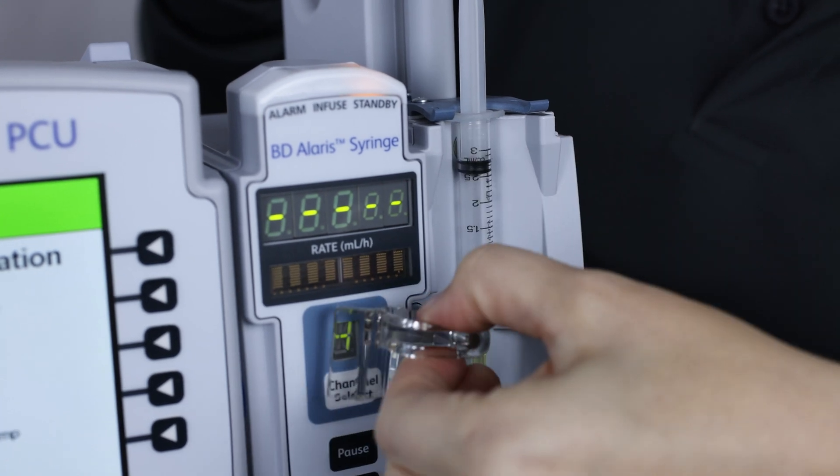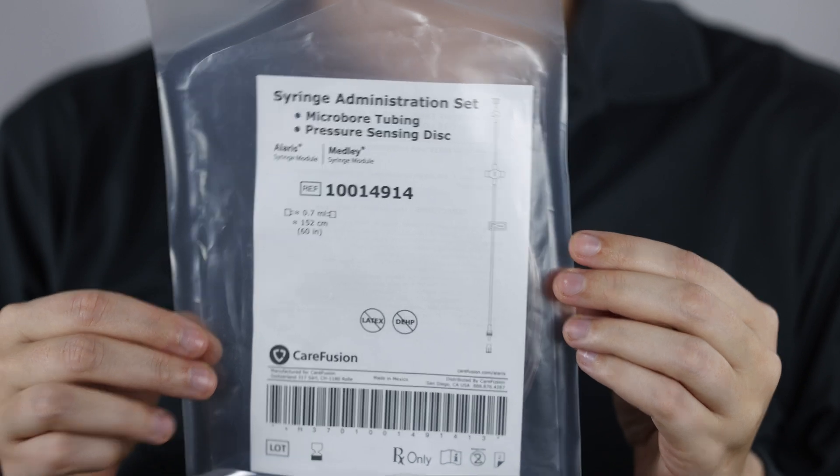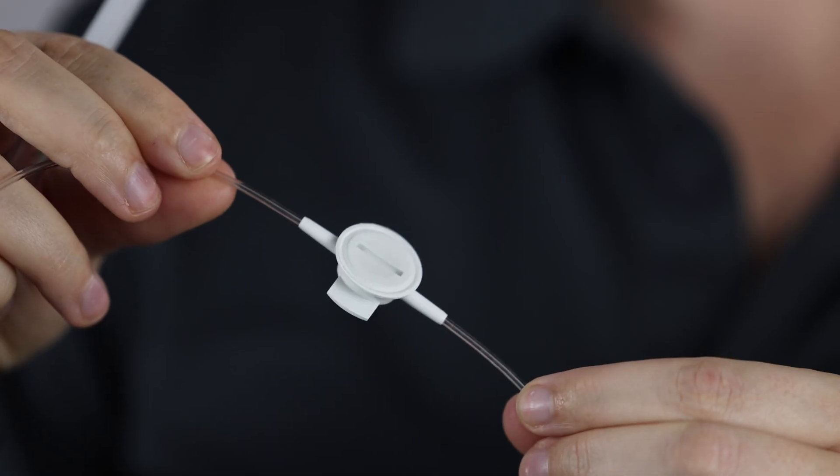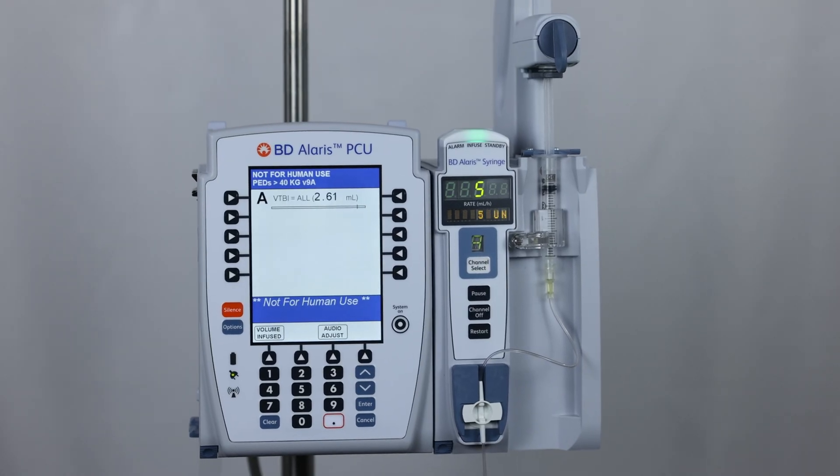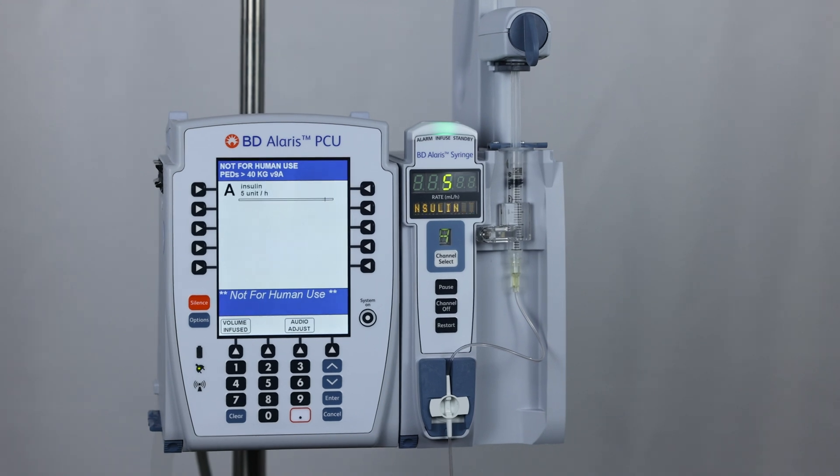Specific tubing sets manufactured by BD are available that include a special sensor disc that closely monitors the pressure inside the line when connected to a patient. The flow rate range for the Alaris 8110 is from 0.01 to 999 milliliters per hour.